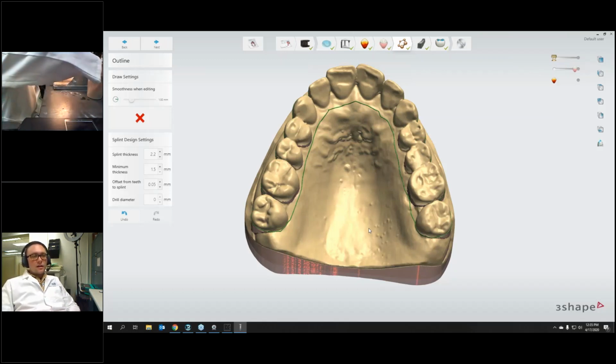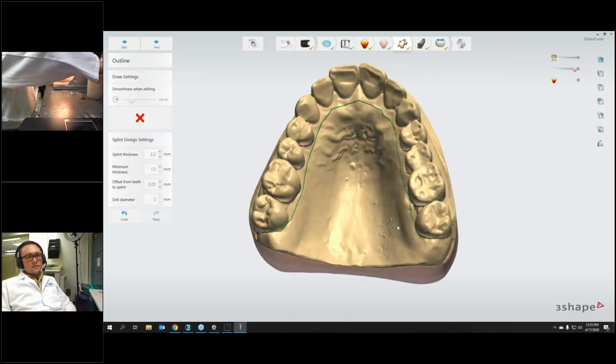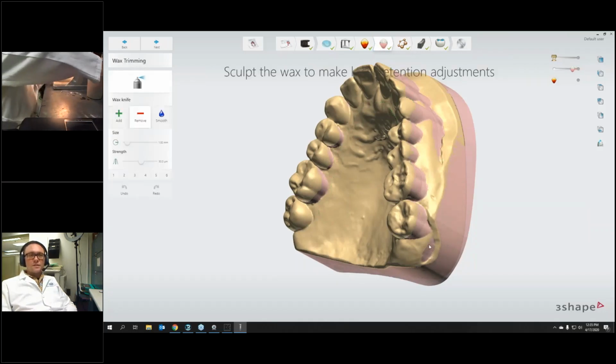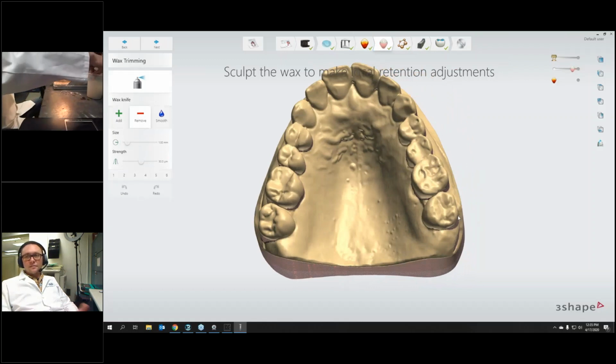If you are going off of an analog impression, then what you would want to do, kind of like what we saw earlier, is deal with any pulls in the impression material or bubbles. You'd want to sculpt that out if you're not going to actually pour a model and then clean up the model, or if you're going to do an impression scan, then you would want to virtually clean that up. And then really the big thing would just be the accuracy of the scanner and the quality.